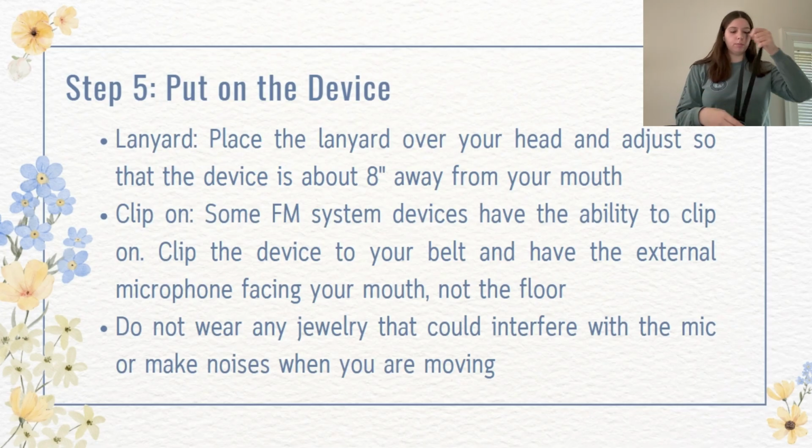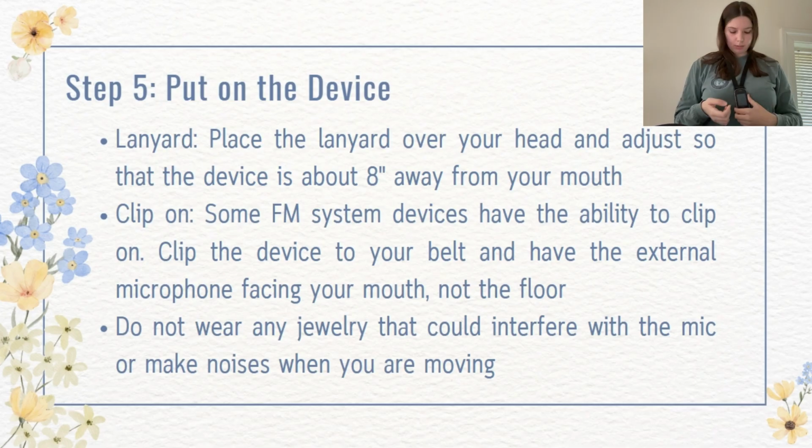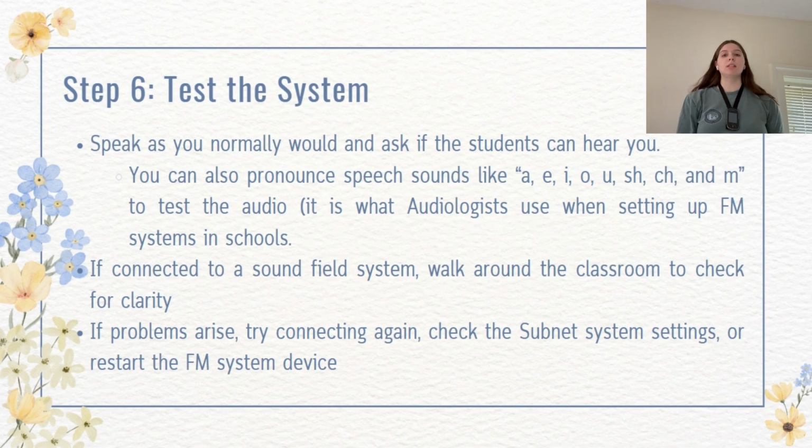So for the lanyard, you are going to put this on over your head, and this is hanging kind of low. So you're not going to go like this. You do not need to go like that. You are going to pull this tab and it will shorten the lanyard bit. You're going to want to have it 8 inches away from your mouth. So if you make it as flat as you go like this, it should be about 8 inches. So, yes. Cool.